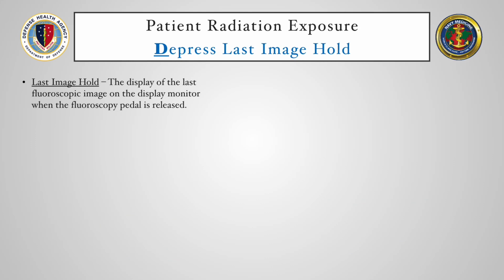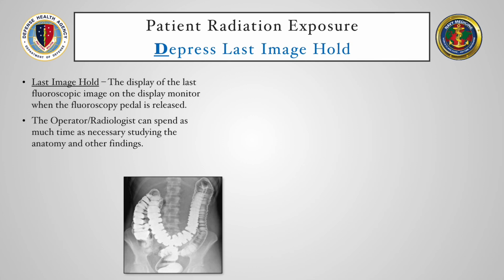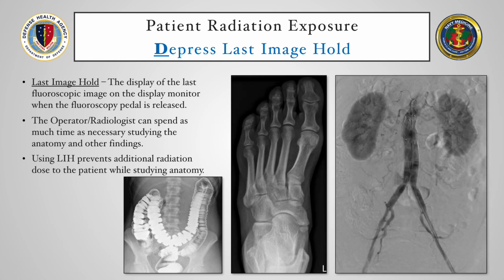Last image hold is the display of the last fluoroscopic image on the display monitor when the fluoroscopy pedal or hand switch is released. By use of this function, the radiologist can spend as much time as necessary studying the anatomy and other findings without incurring additional radiation dose to the patient. Always use last image hold when possible to study the anatomy.